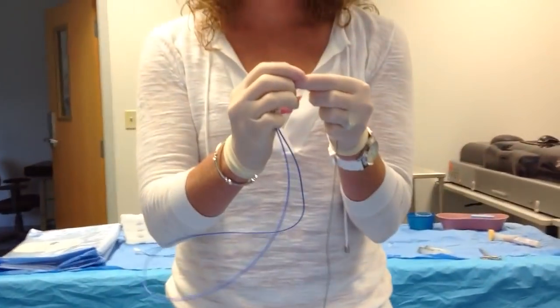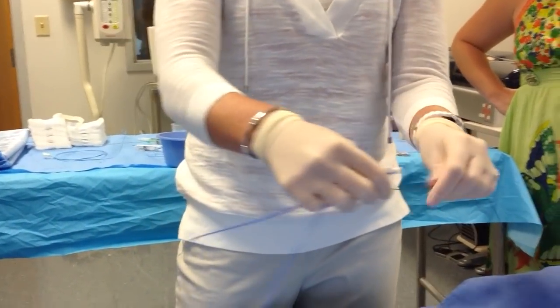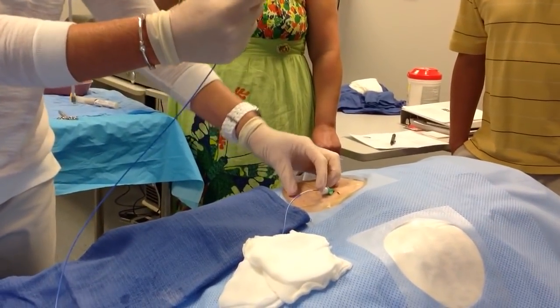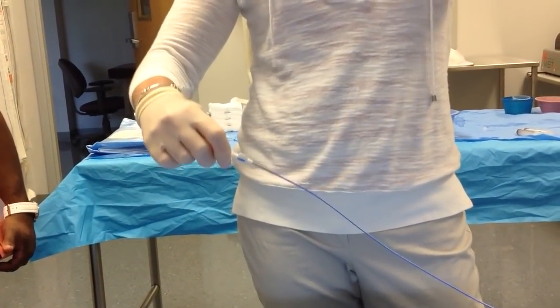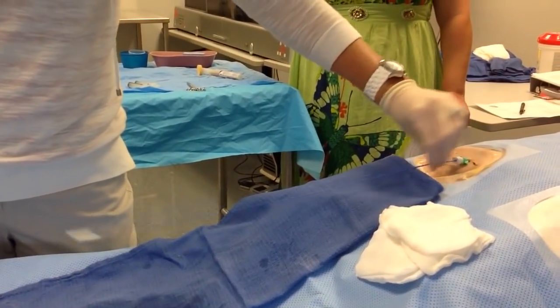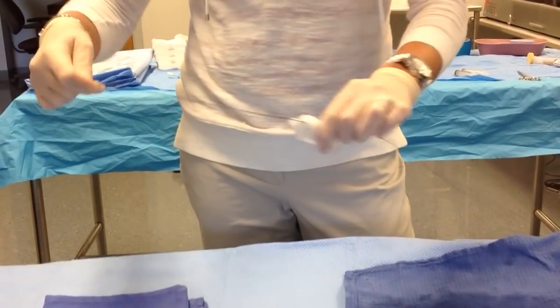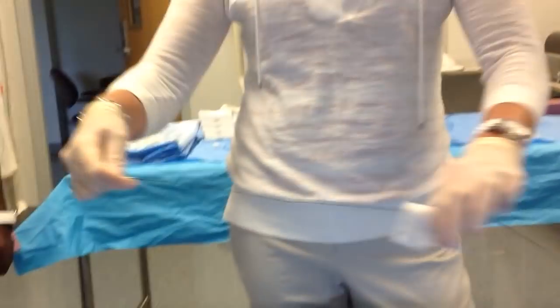So we have our JR4, and now you're going to load it this way. So you're just going to take it on the back end here. And you don't want to advance it until you get wire coming out the back, okay? So when you see that, then the physician will take this, start advancing it, and now remember the guide wire should be in front of the catheter. Once it gets over the arch, you pin the wire, they advance the catheter. Once the catheter meets the guide wire over the arch, then you can take this out. Now, I'm going up here to hold onto the catheter to get it, but they're holding onto the catheter for you, so you don't have to worry about pulling it out.